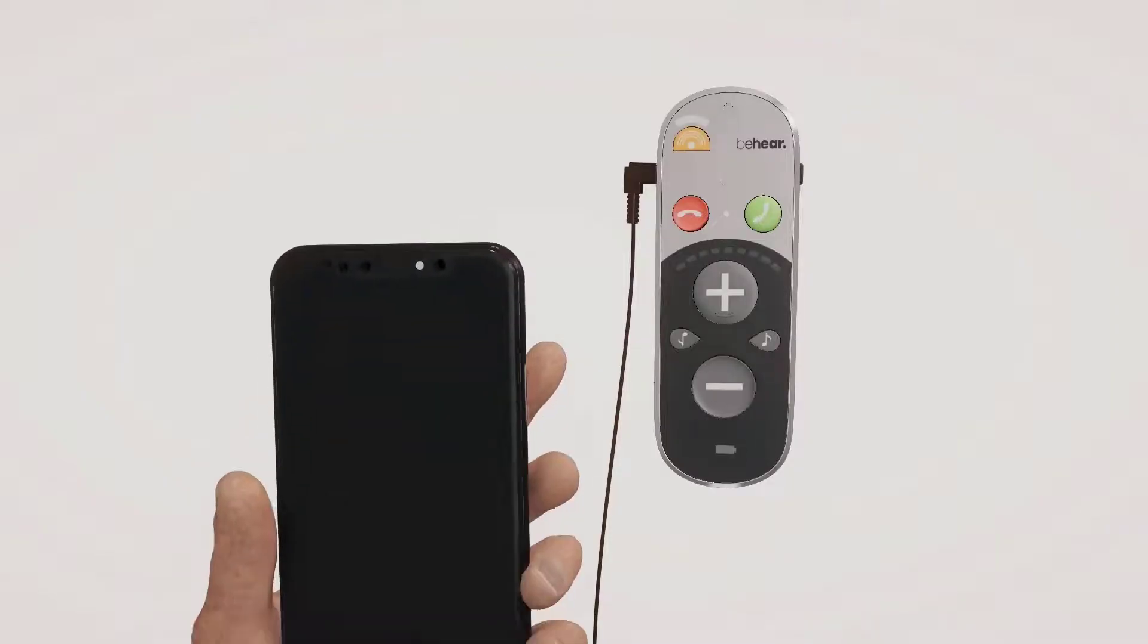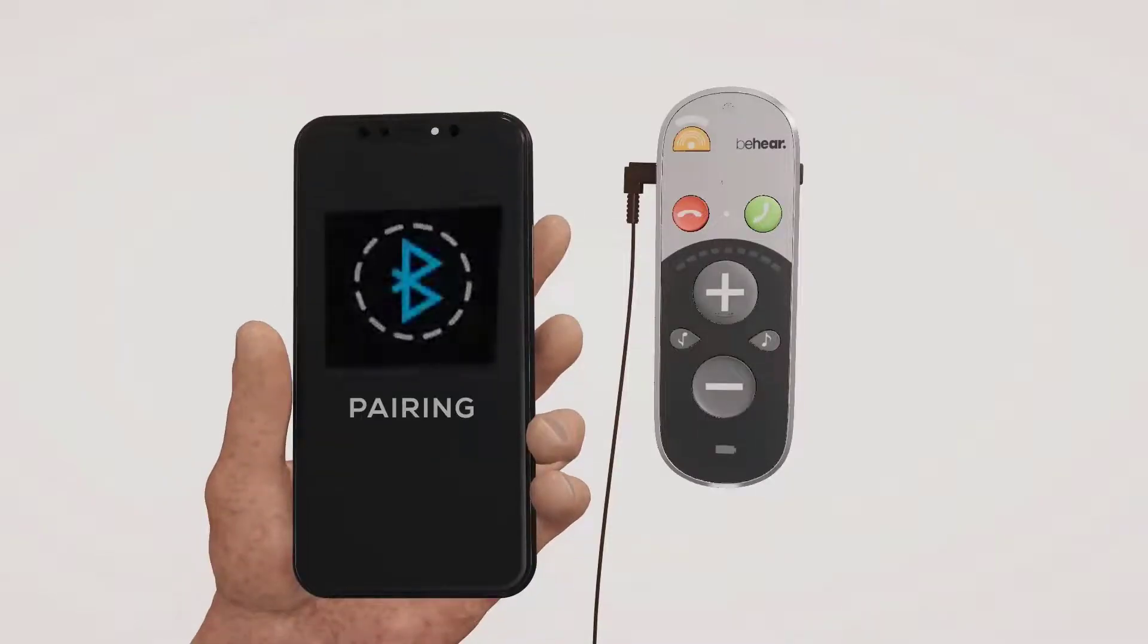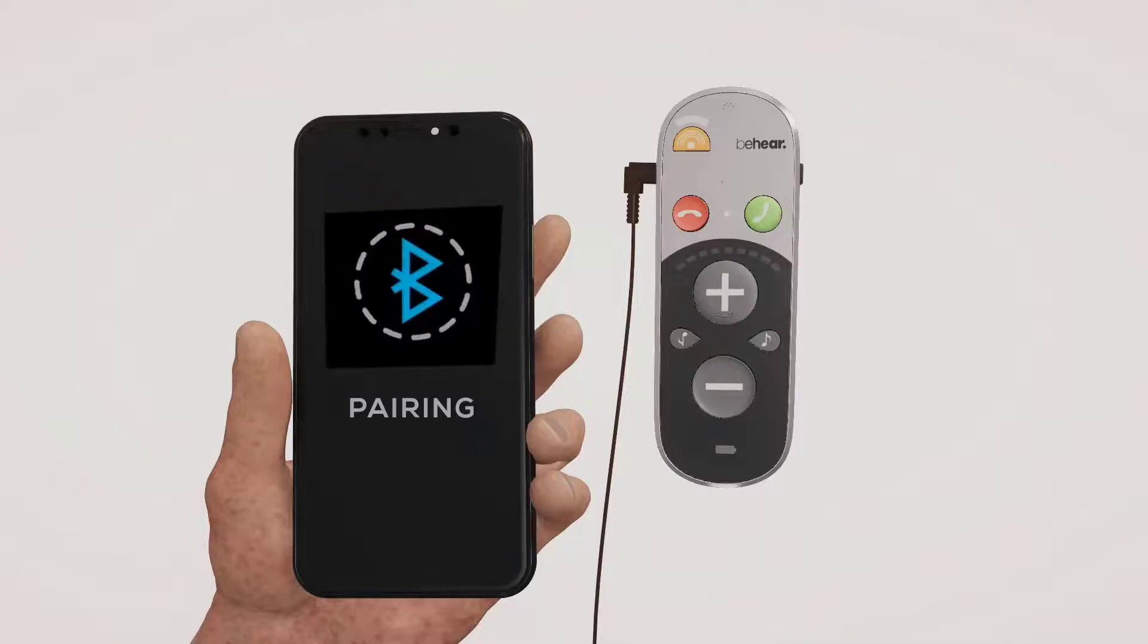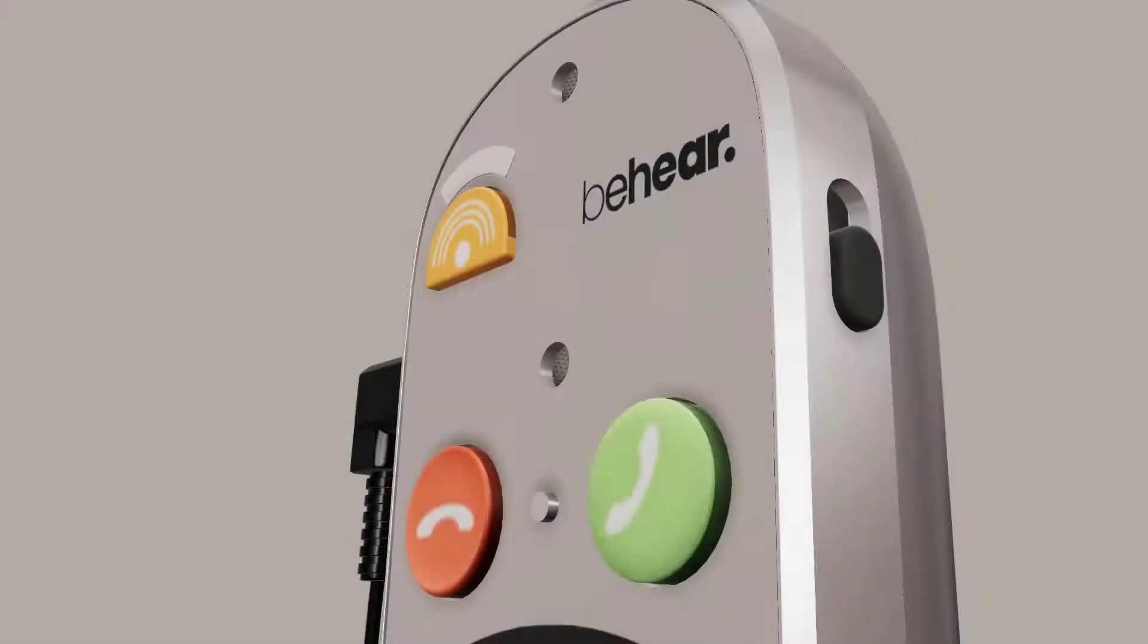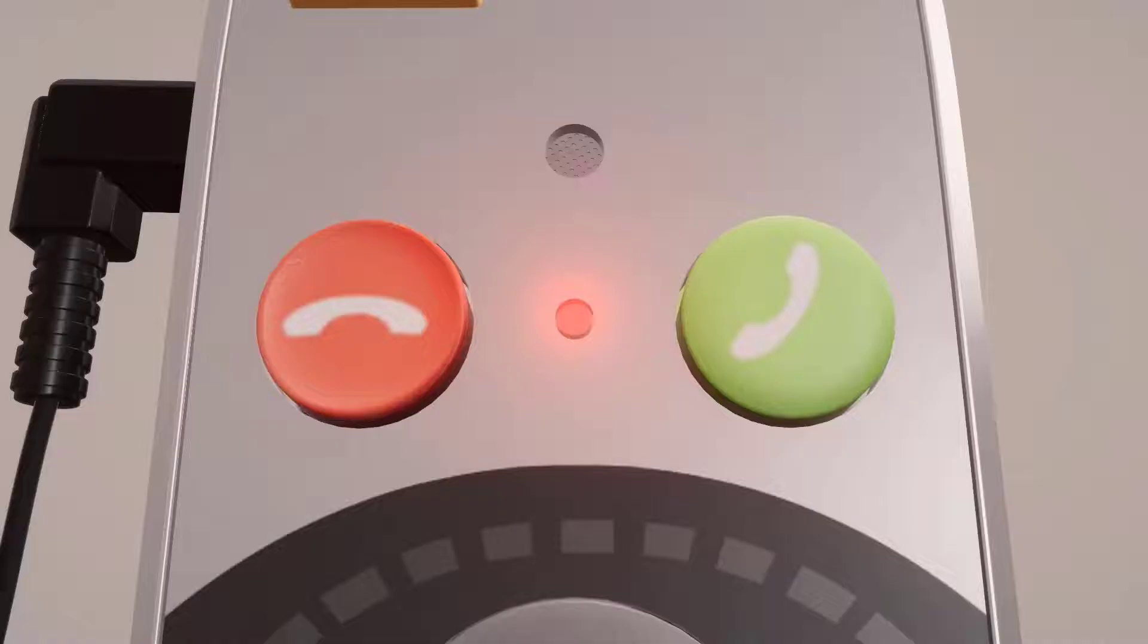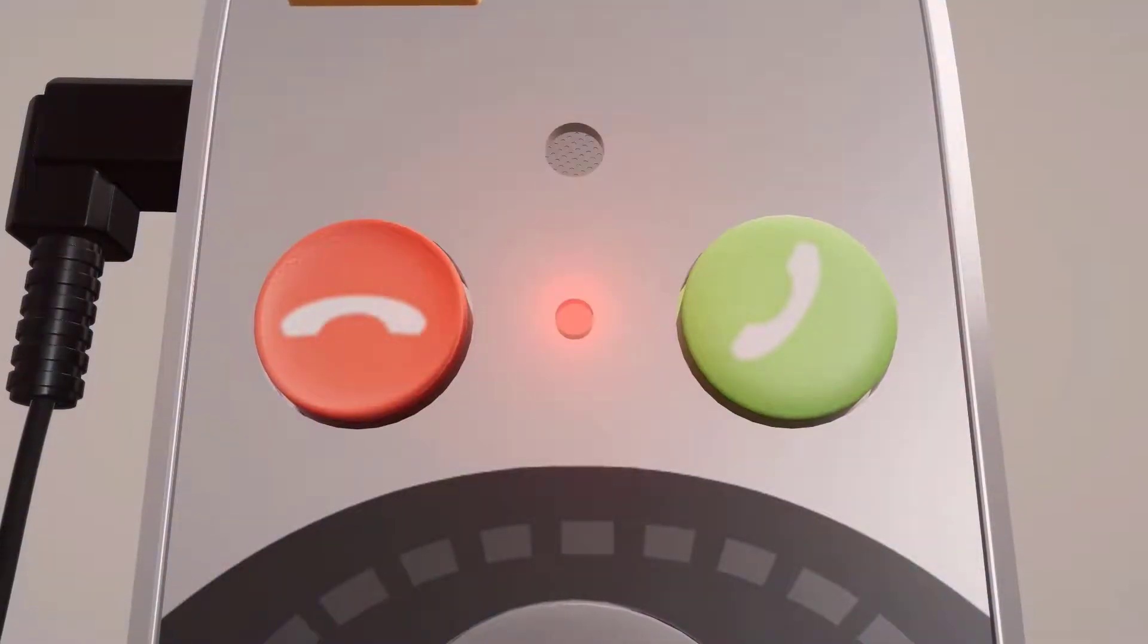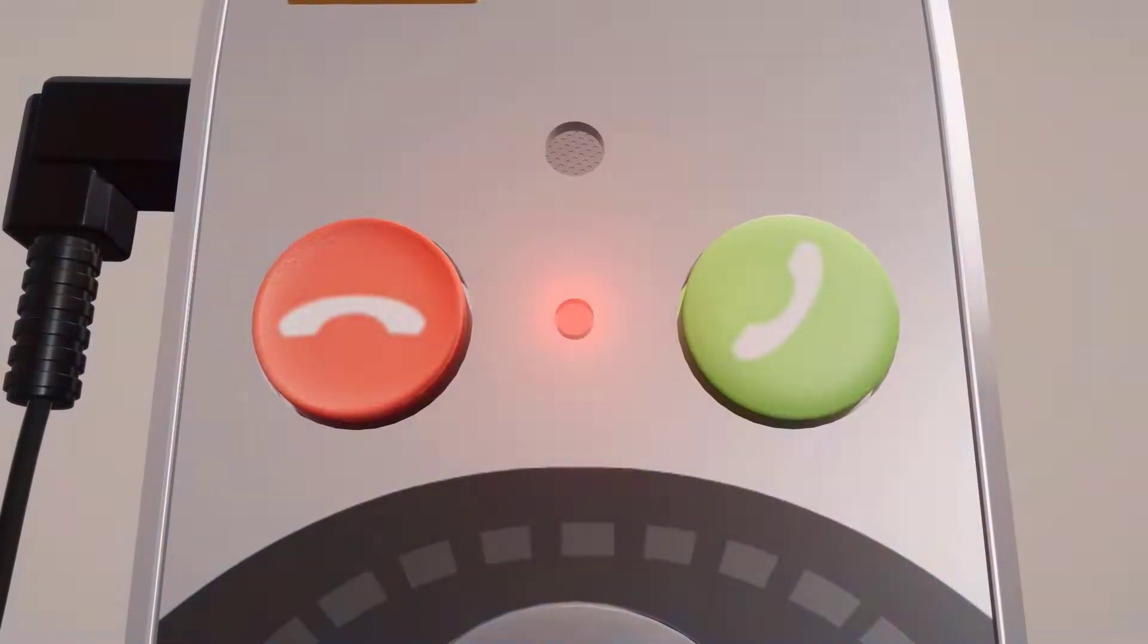Access the pairing settings screen of the Bluetooth device. Make sure Smarto is off, then slide and hold the power button for 5 seconds to place Smarto in pairing mode. The LED will blink in alternating red and blue.